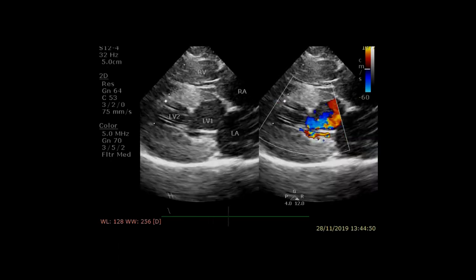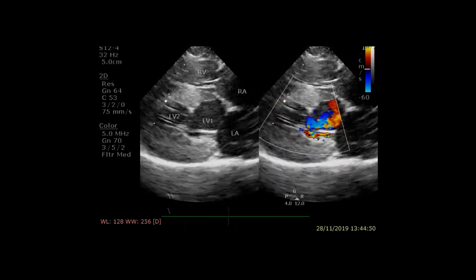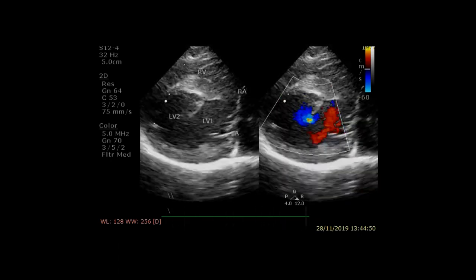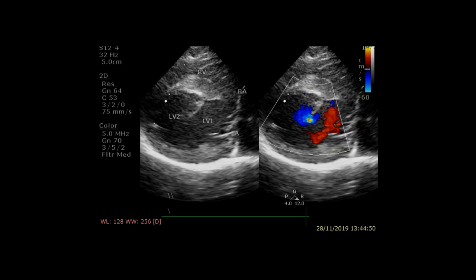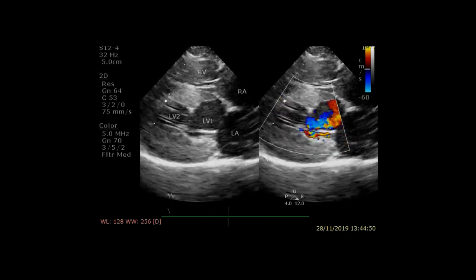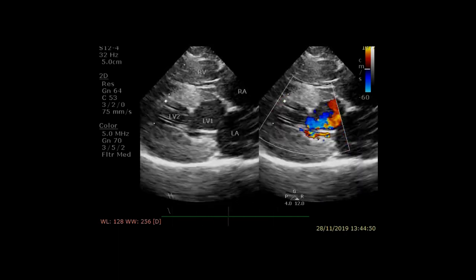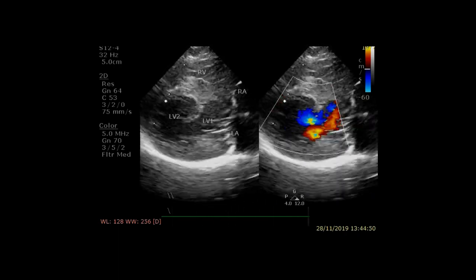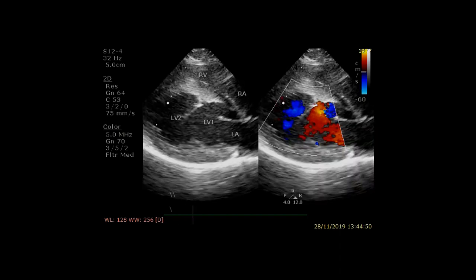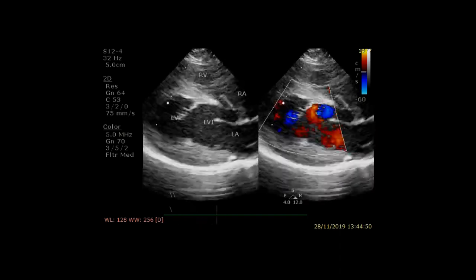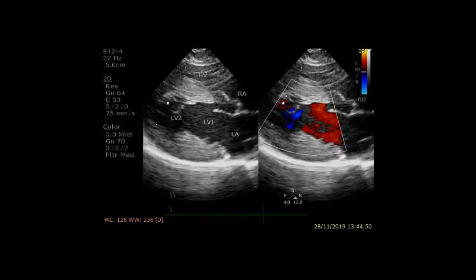With colour flow added, you can see that turbulence is being created in the mid portion of the left ventricle during systole as the false tendon appears to cause an obstruction to outflow. Again, slow motion is useful to demonstrate this.